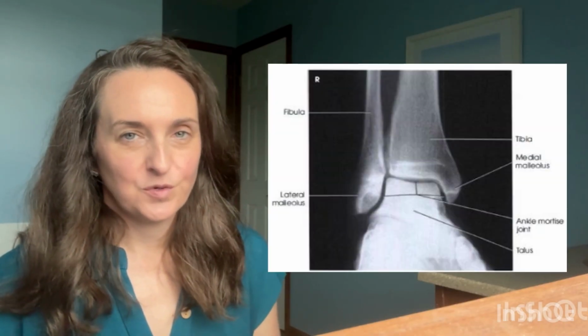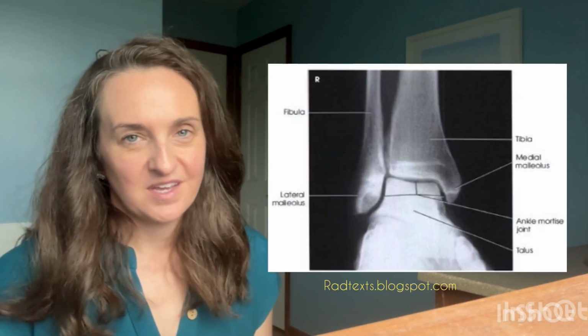Be sure to stay tuned to learn why the ankle Mortise view is the most important ankle X-ray. Let's start with why the ankle X-ray positioning is so important.